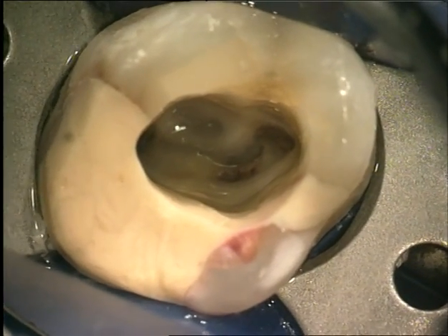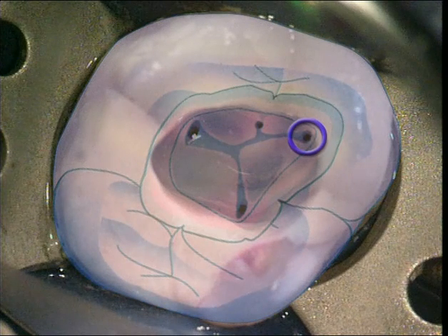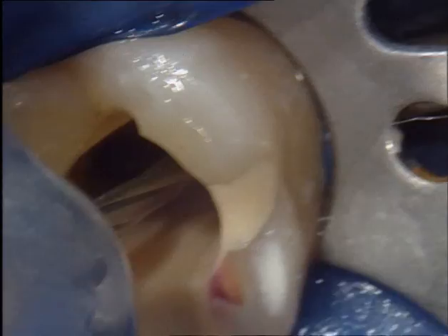In upper molars, the typical outline of the access cavity looks rhomboidal. Studies have shown that the mesiobuccal root manifested two root canal systems in approximately 90% of the time. By carefully removing the secondary dentin towards the palatal side of the mesiobuccal orifice, an MB2 system can often be found with the endodontic explorer.